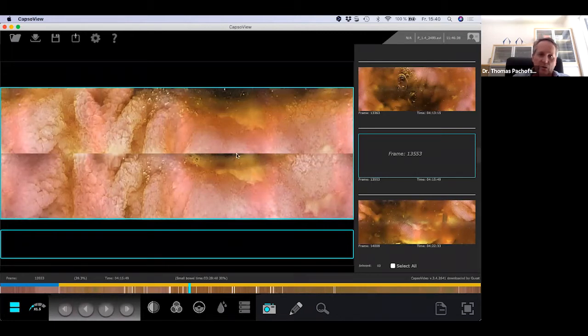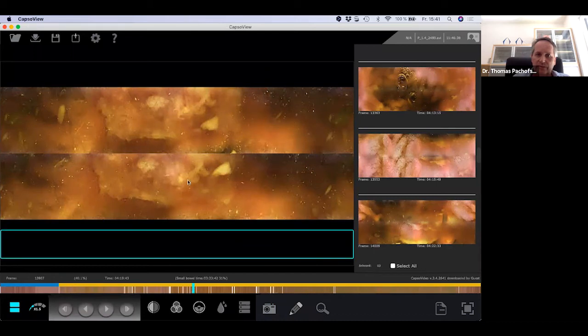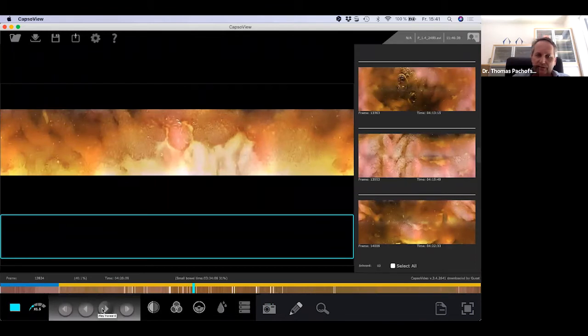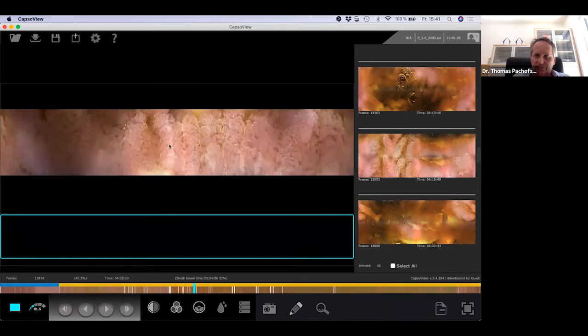and with large ulceration with a stricture where the capsule can't go by, and where we can see also a lot of inflammation here again, ulceration. And sometimes it's quite hard because you can't say, is this now a new lesion or is this the same lesion from another side? You have another angle of the picture. So it's sometimes quite hard to say, is it this? But here again, you can see the inflammation and the edematous really in this area.